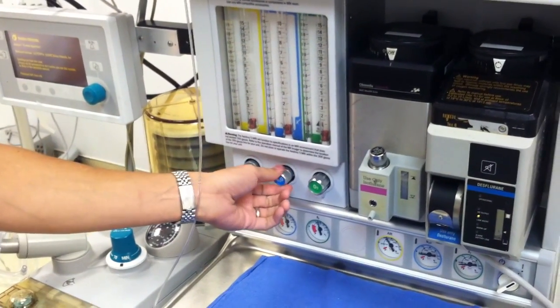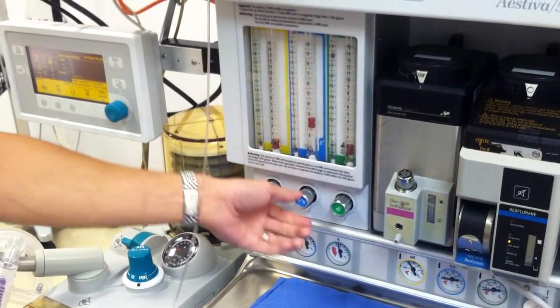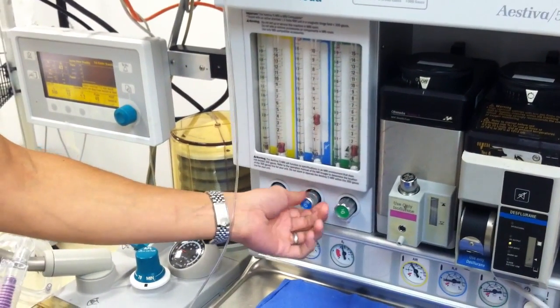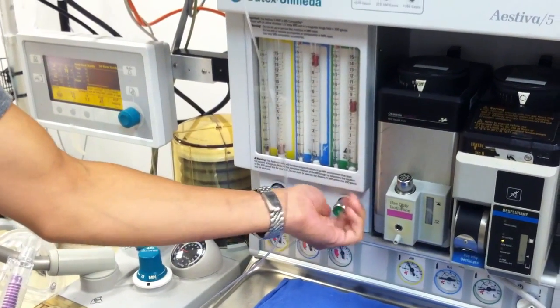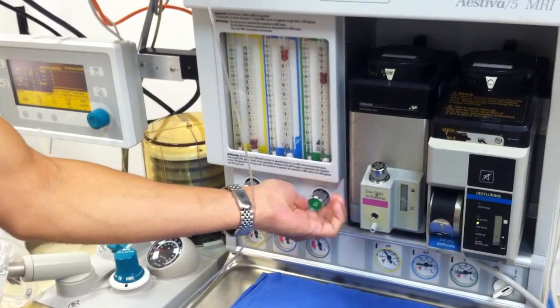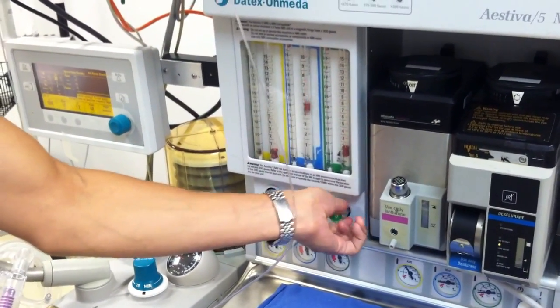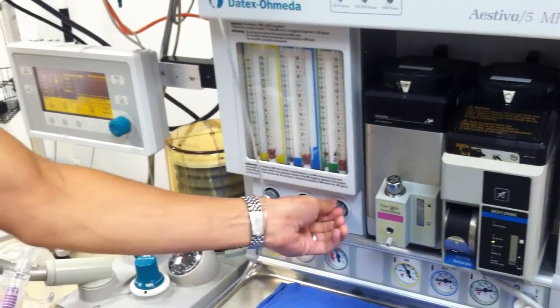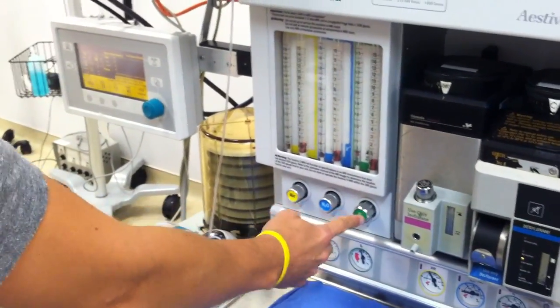Now with the Link 25 for this machine, we're going to turn on nitrous oxide and make sure there's always a 3-to-1 ratio with oxygen. We'll take nitrous all the way up, then take oxygen all the way up — make sure it goes up without getting stuck. As we bring oxygen down, the Link 25 should also bring down nitrous oxide. We just want to verify that — which it does, so we're good.